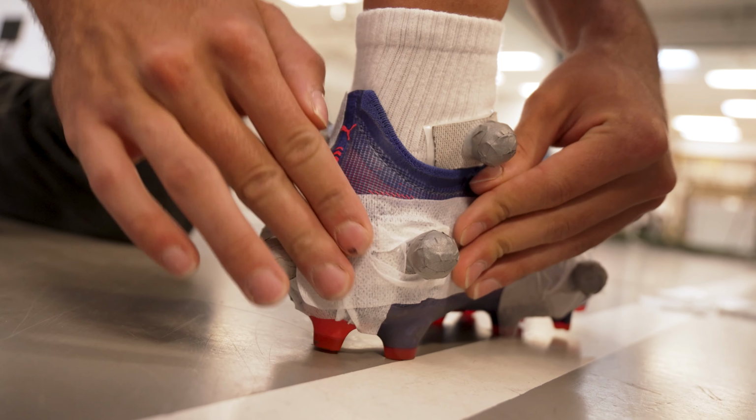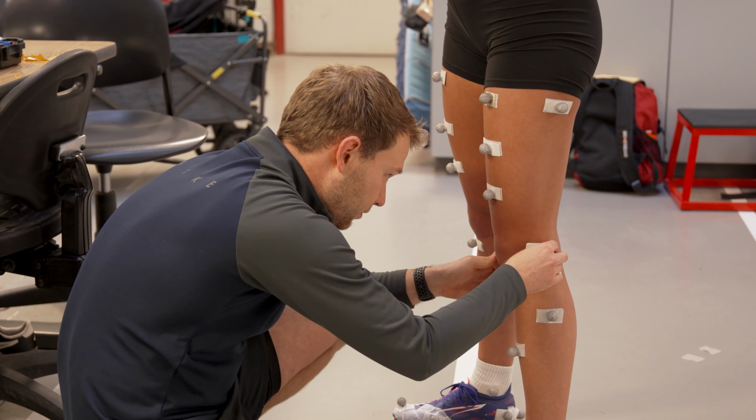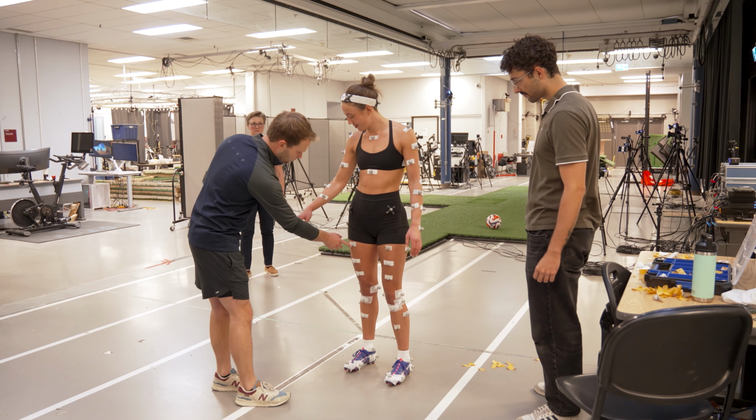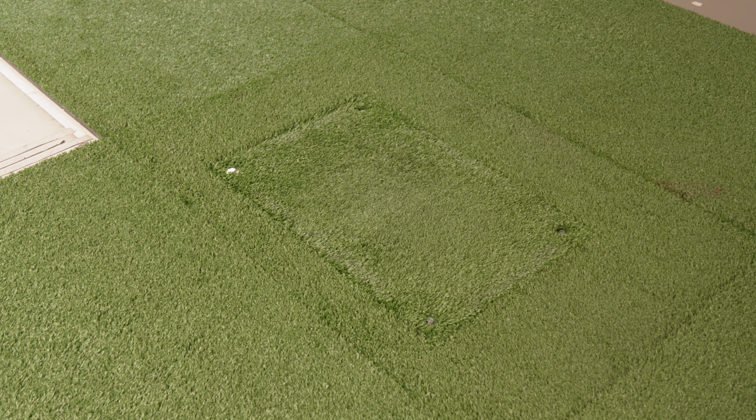reason behind the injury. So my research project is focused specifically on university female athletes, in particular soccer and basketball athletes. We are looking at ACL-related knee loading patterns in cutting and landing maneuvers, and we try to make them as sport-specific as possible using our three-dimensional motion capture and force plate technology here.